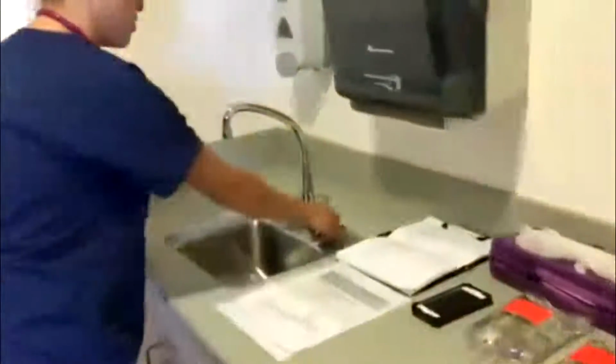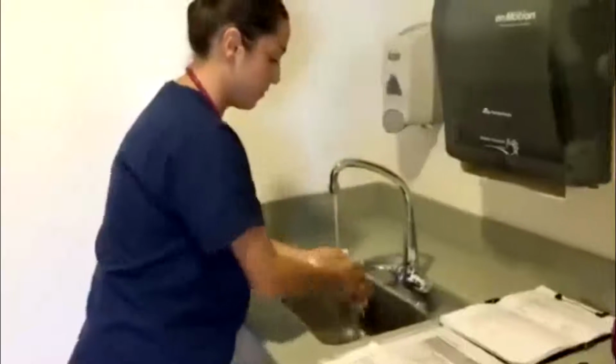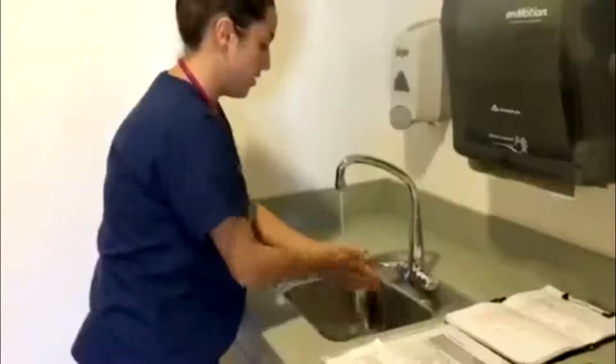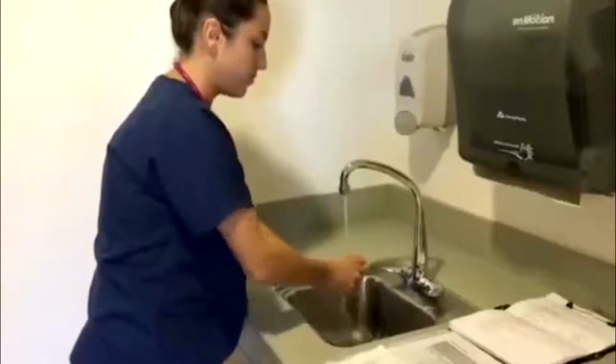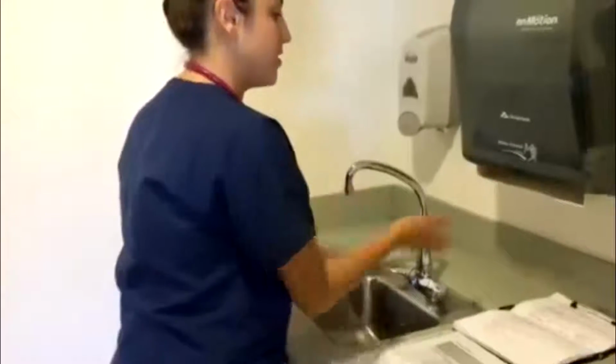So I'm going to go ahead and wash my hands, at least 15 to 30 seconds. And I want to glove up before I prepare and spike my medications.